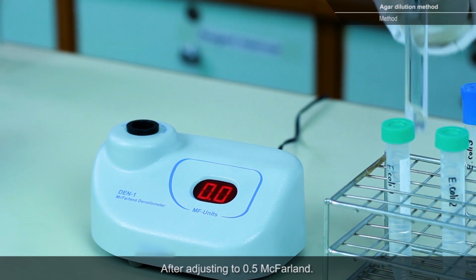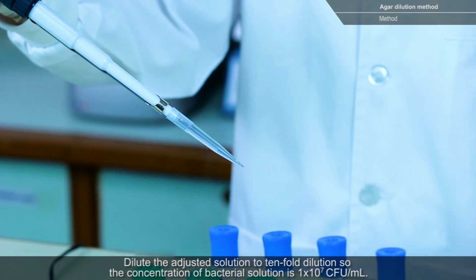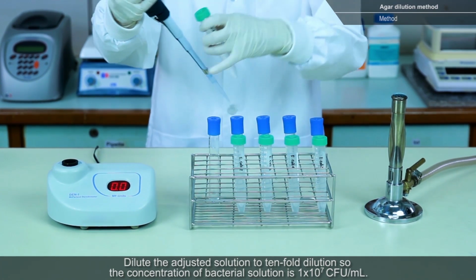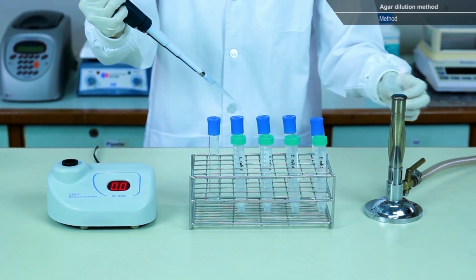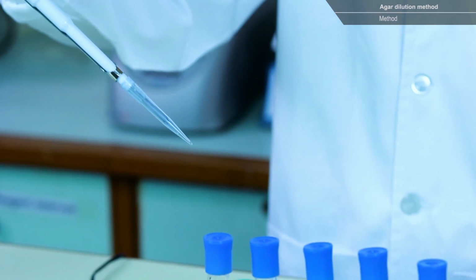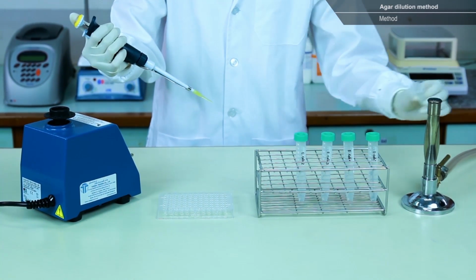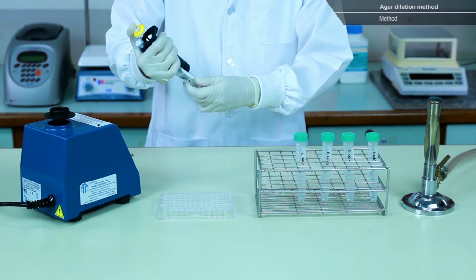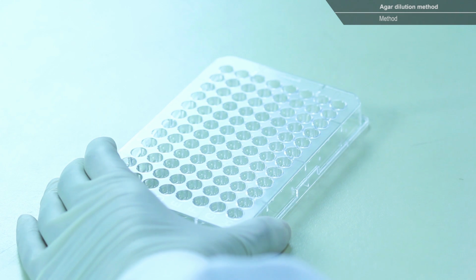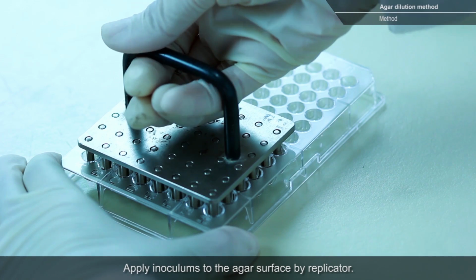After adjusting to 0.5 McFarland, dilute the adjusted solution to a 10-fold dilution so the concentration of bacterial solution is 1 times 10 to the 7th colony forming units per milliliter. Distribute the diluted solution into a microtiter plate, and apply inoculums to the agar surface by replicator.